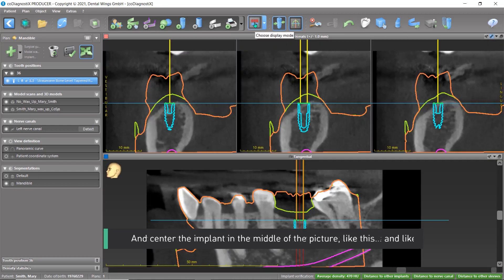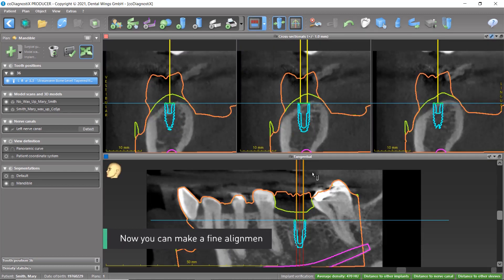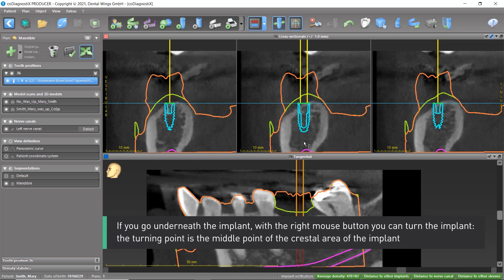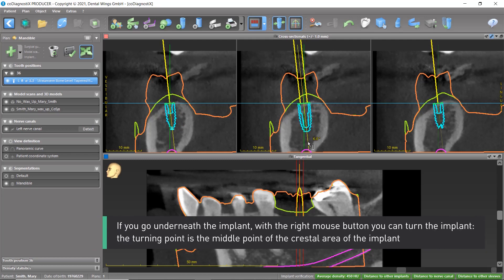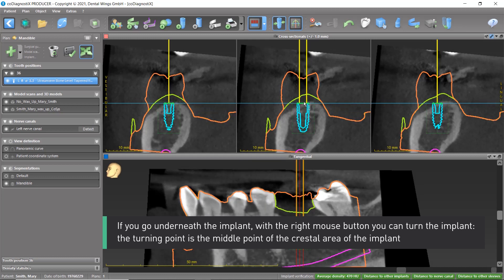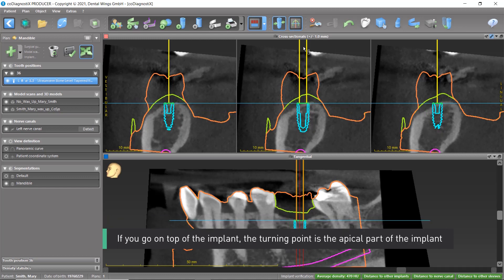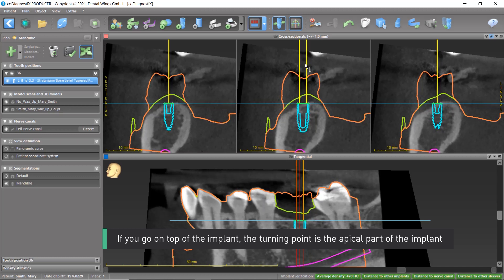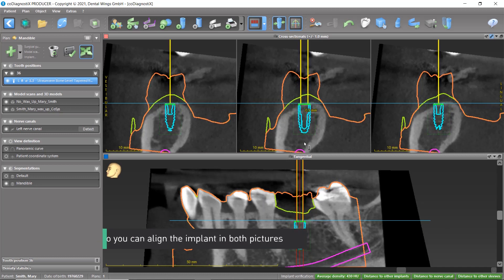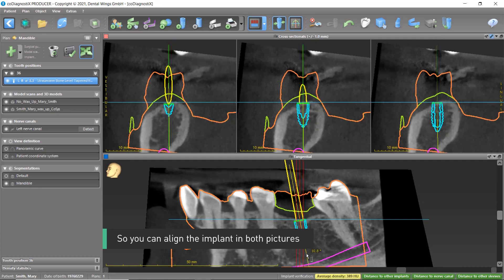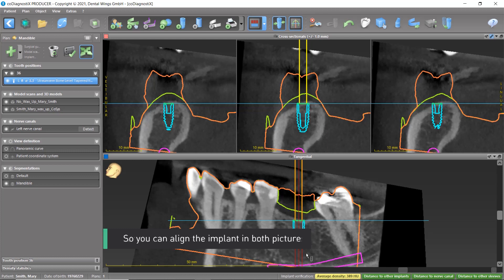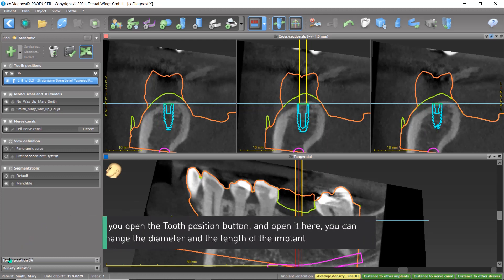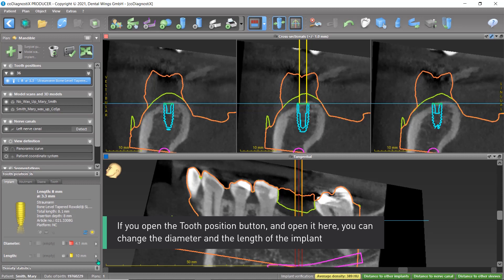Now you can make a fine alignment. If you go underneath the implant with the right mouse button, you can turn the implant — the turning point is the middle point of the crestal area. If you go on top of the implant, the turning point is the apical part. This allows you to align the implant in both pictures. You can also open the tooth position button to change the diameter and length of the implant.